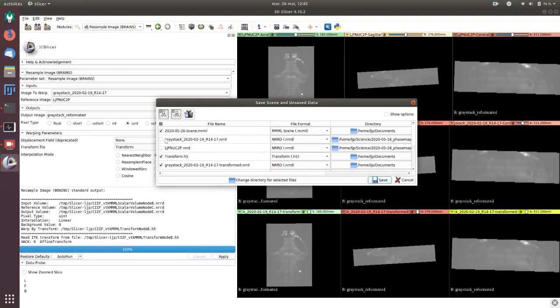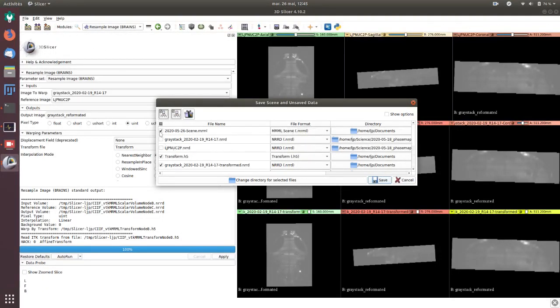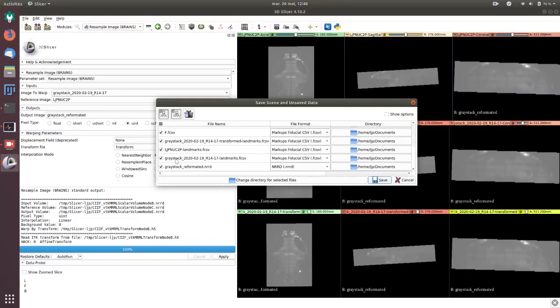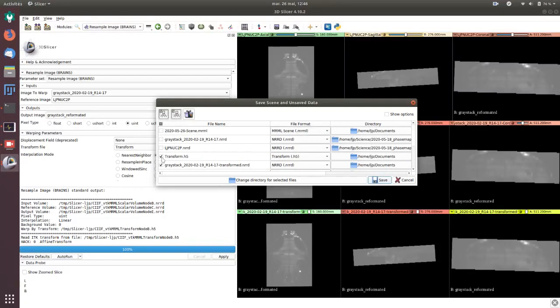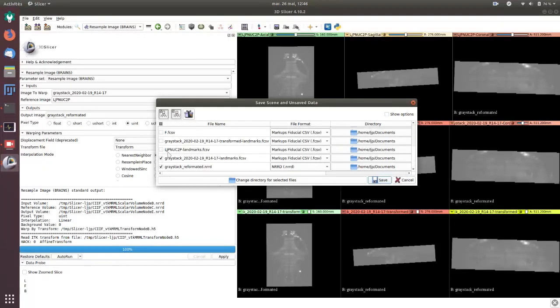Check what you want to export. Here I don't need the scene which is just a way to find back the same scene in 3D Slicer. I don't want to have this because I already have them in this folder. I want to export the transform file and I don't want to keep the landmarks but you can keep it and reload it after.